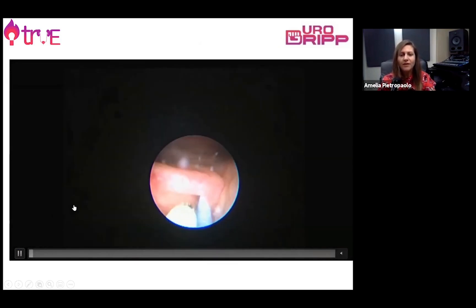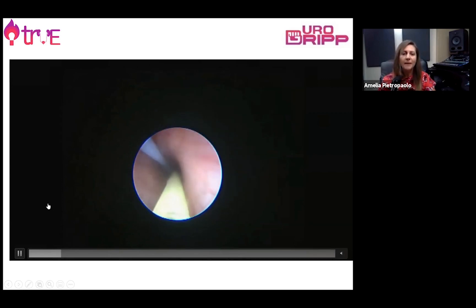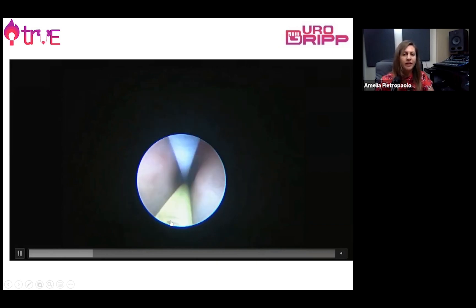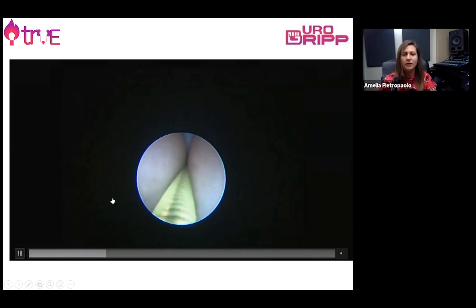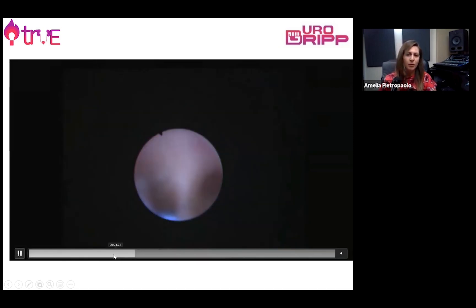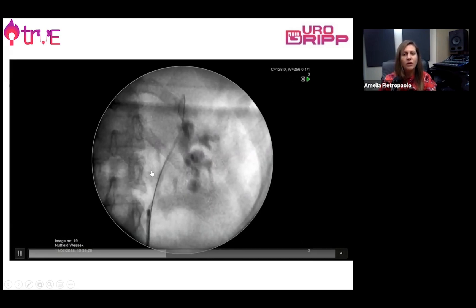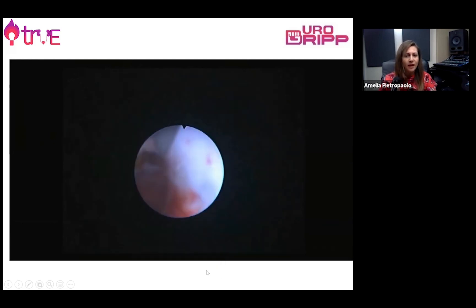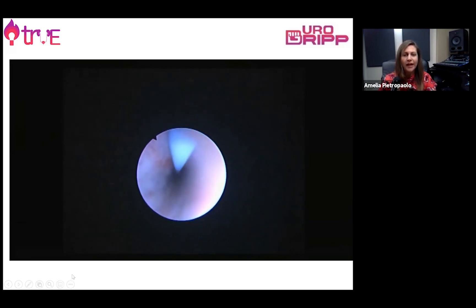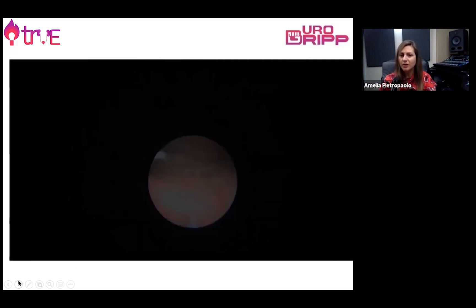To conclude, I want to show a video of our suggested step-by-step approach to flexible ureteroscopy. The first step is to do a rigid ureteroscopy to navigate and test the compliance of the ureter. We normally use a safety guide wire and then a working guide wire through the ureter. As you can see, this ureter is very narrow, so we should not select a very wide access sheath — probably 9.5 French. After inserting the access sheath, we can safely perform flexible ureteroscopy and remove even large stones through it. At the end, we navigate backwards with our access sheath to check that there are no damages to the ureter.